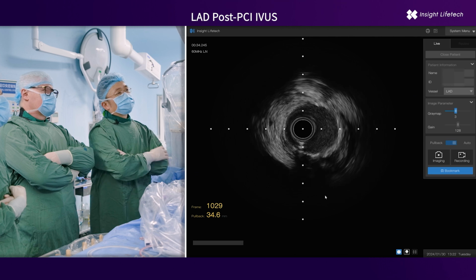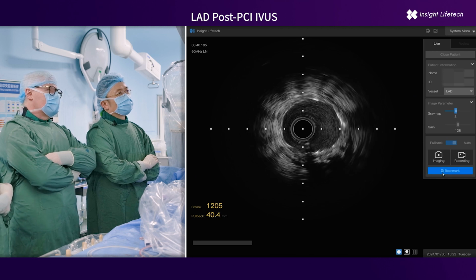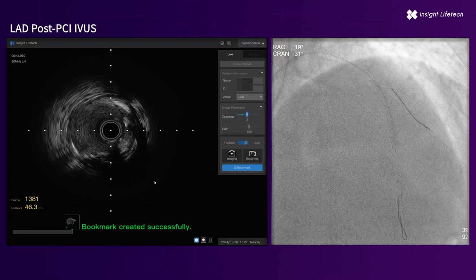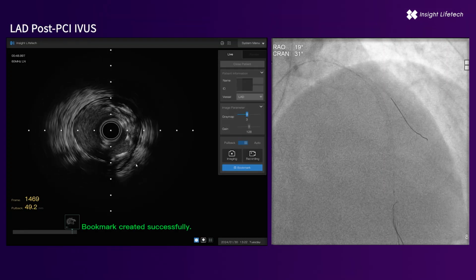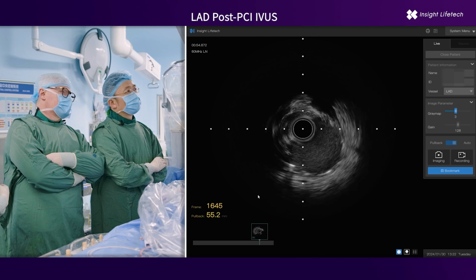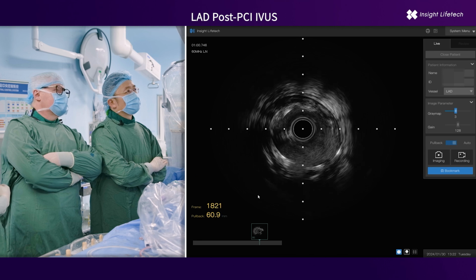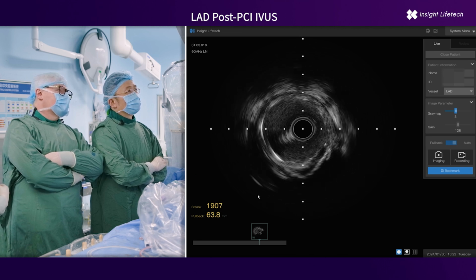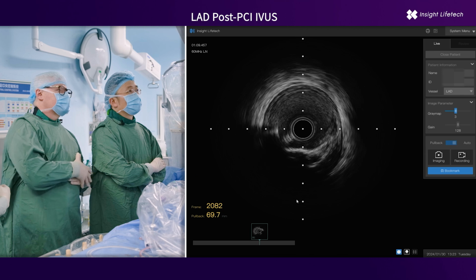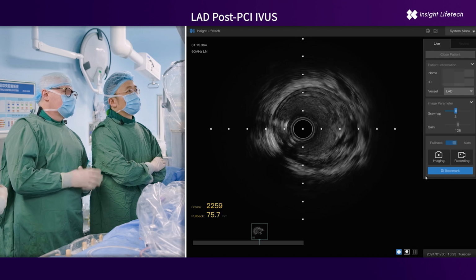Of course, there is the plaque outside of the stent, but it will stay there. We are concentrated on the lumen, which is good, all along the vessel. Patient is still asymptomatic. Diagonal was probably okay, and we have this tapering. With this post dilatation, you achieved good tapering of the stents. Proximally, we see the lumen, which is at least more than 3.0. And the proximal edge, it's not so bad, maybe a little bit of under expansion, but we covered what we wanted to cover. So the length of the stent is appropriate.